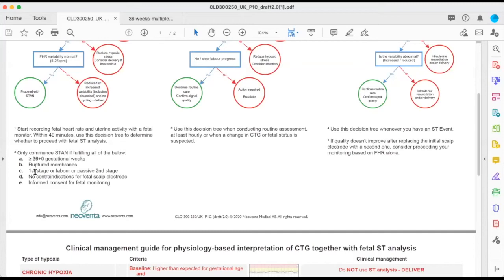Okay. One of the other contraindications is precipitate labor. Things are progressing super fast. So I've started this, she's 2 centimeters, she's now 6, she's now fully dilated, she's pushing, all within the hour. Can I miss something within this progress? That's why I'm saying this baby has to be at a stable and steady state.